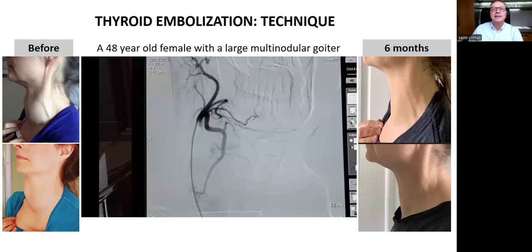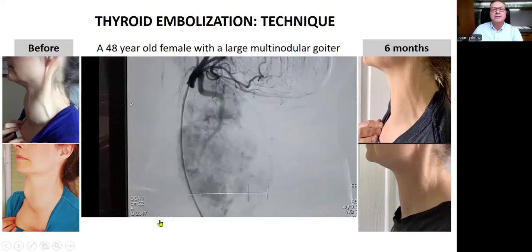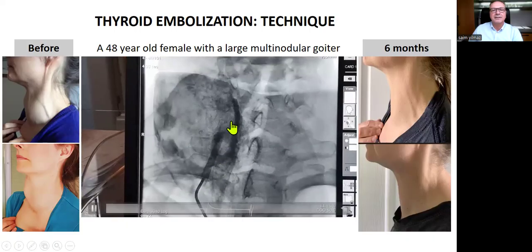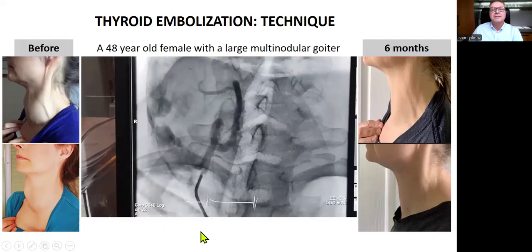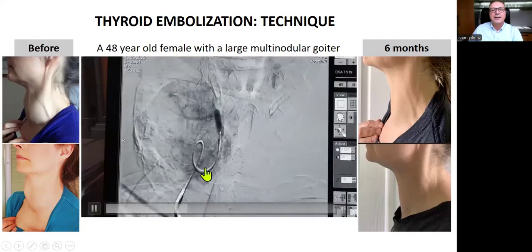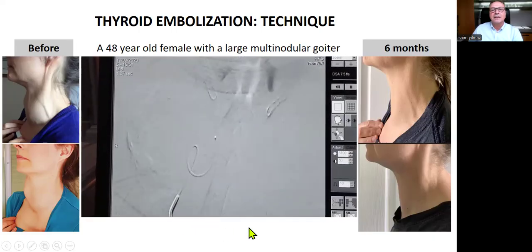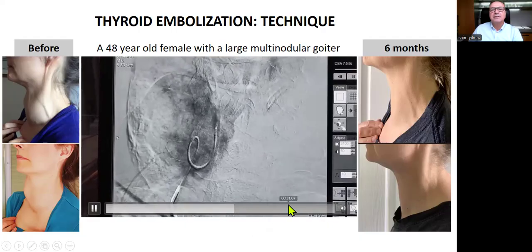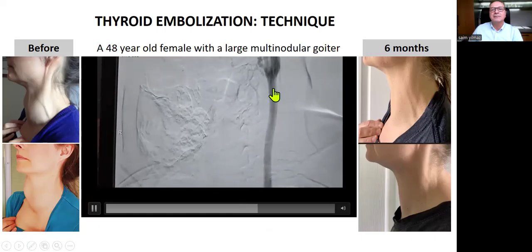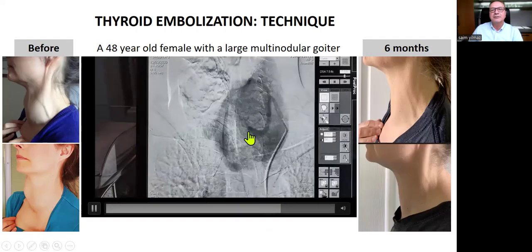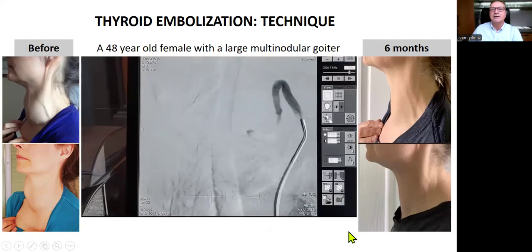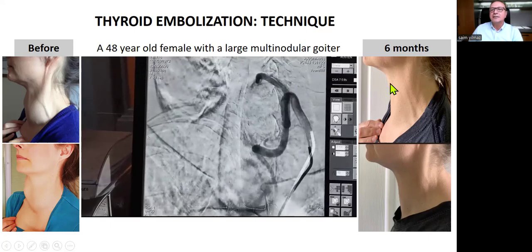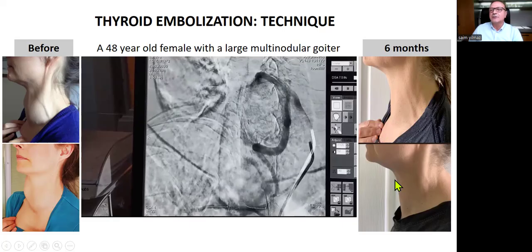This is an example — a 48-year-old lady with a large multinodular goiter. This is before the procedure; she has large lumps in her neck. This is the right superior thyroid artery and right inferior thyroid artery during the embolization. After embolization, you see the stagnation. The left superior thyroid artery is not feeding the large nodules, so it is practically normal. But the left inferior thyroid artery does, so we embolize this artery also. This is the picture of the lady at six months — she has almost a normal-looking neck and she is very happy with the outcome.